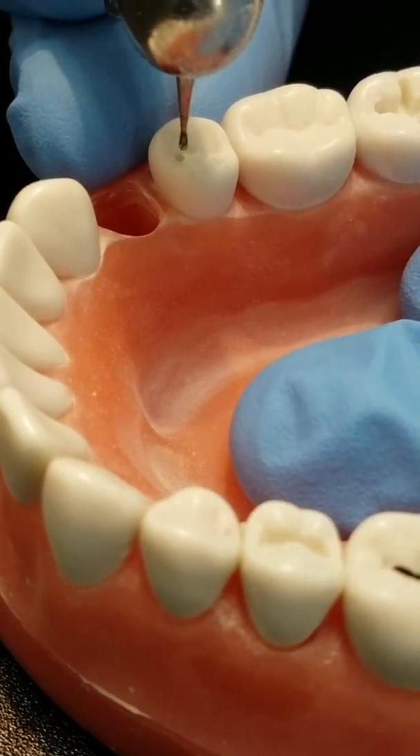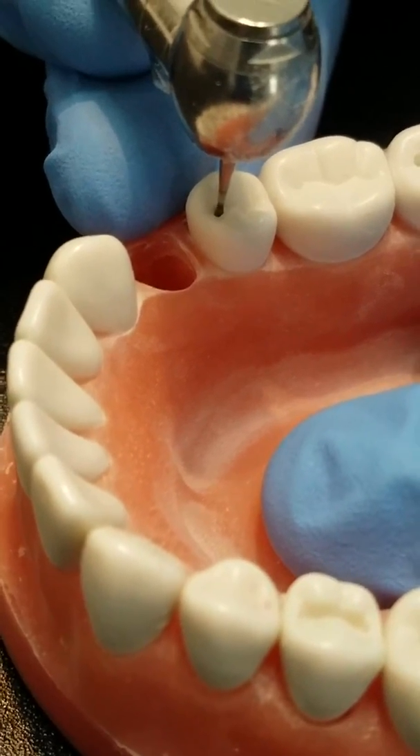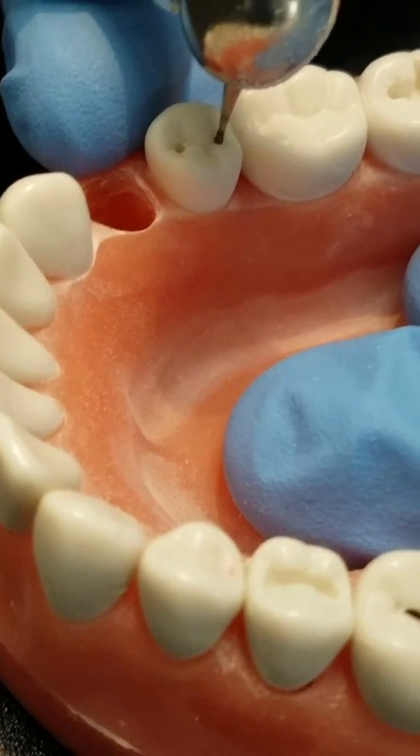This is Ralph and I'll be demonstrating how I do an ideal class 1 prep for an amalgam filling. One of the first things you'll notice is that I never use a slow speed, and I'll explain as I go why I do that.